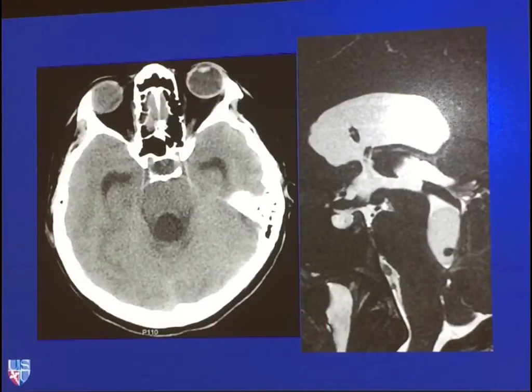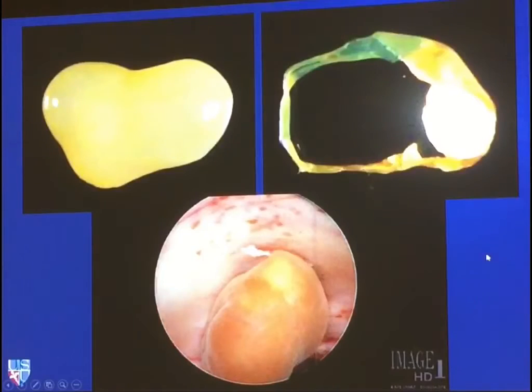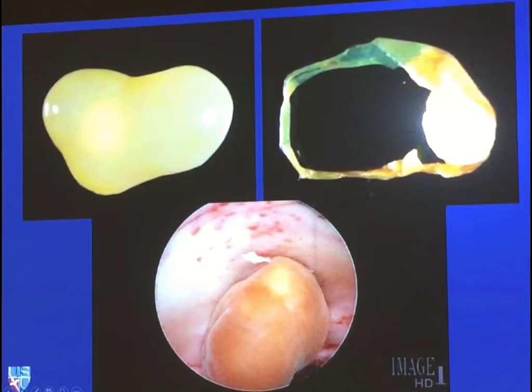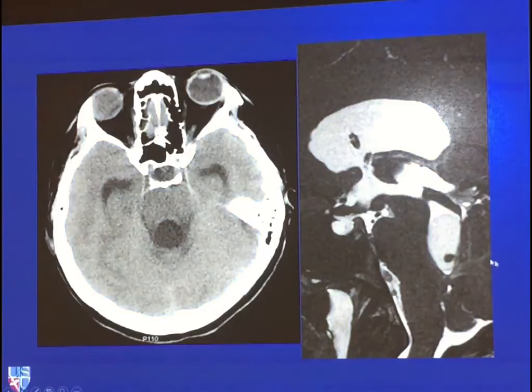Here's another example. We have a cystic lesion occupying the fourth ventricle. We can see that nicely here on this sagittal T2-weighted MR image. Notice that this is the whole lesion, but there's a smaller rounded low signal intensity lesion within it. The patient went to surgery. Here is the intraoperative picture. Here's what they took out, the cystic lesion. They opened up the cystic lesion, and here is that peripheral nodule, which matches up to our low signal intensity focus within the fourth ventricle on this MR image.